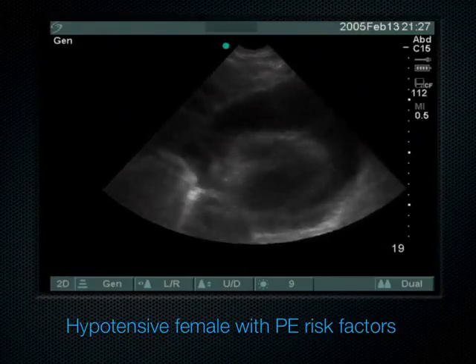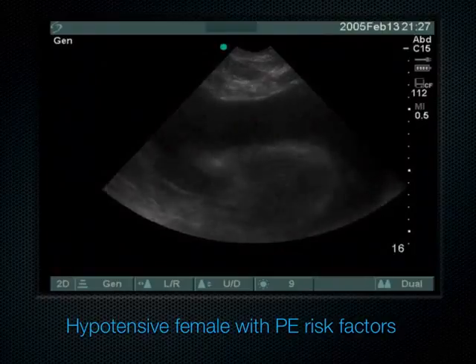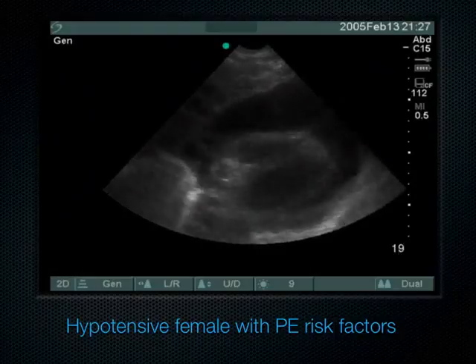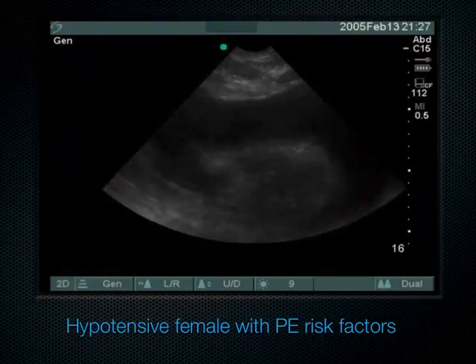What does this patient need? Pericardiocentesis. So, this was a real case. Maybe it was just me being a poor clinician, not being able to figure out the difference between PE and tamponade on a hypotensive patient. Or maybe everybody would have struggled with that and been led down the wrong pathway. It really looked like PE to everybody in the room, but we were all wrong.